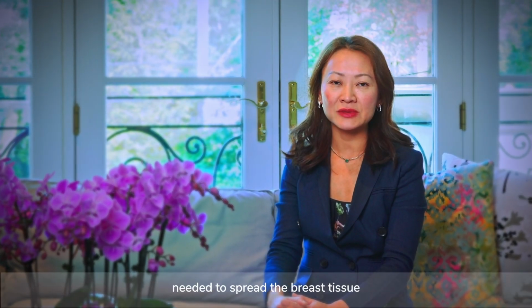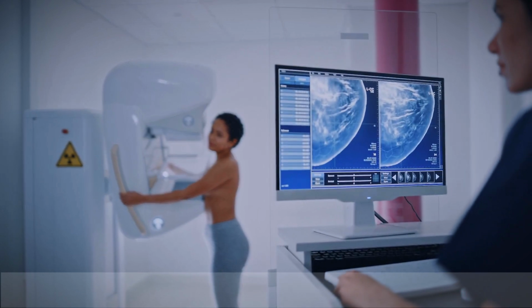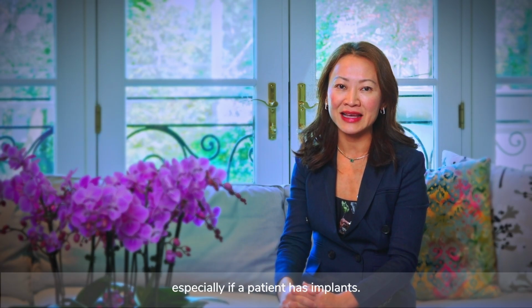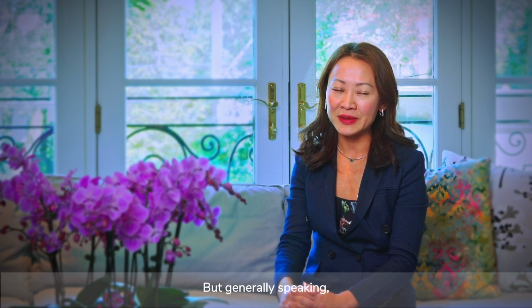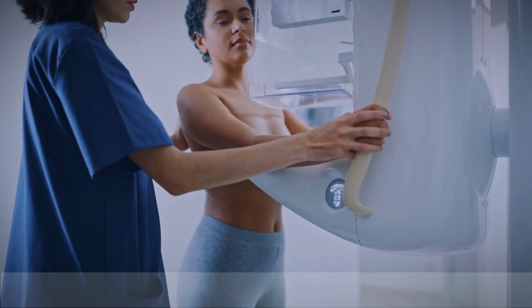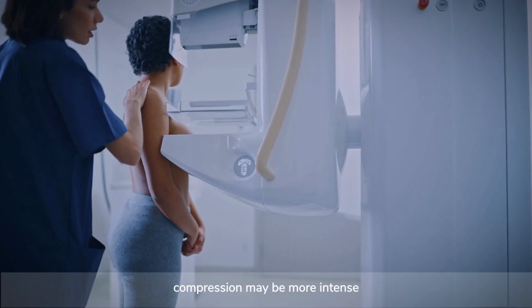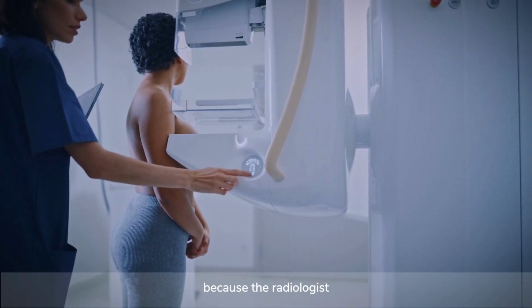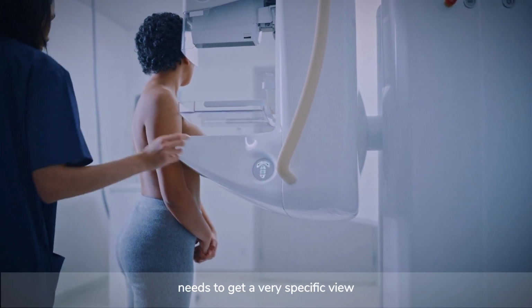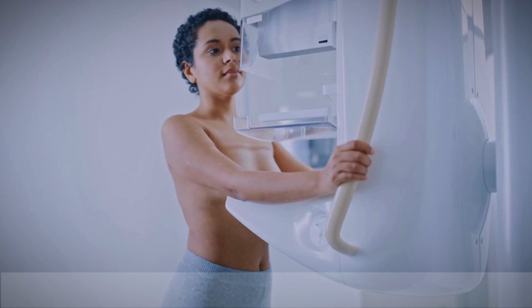Compression is sometimes needed to spread the breast tissue to get a better image, especially if a patient has implants. But generally speaking, compression is less intense in a screening mammogram. During a diagnostic mammogram, compression may be more intense because the radiologist needs to get a very specific view of the certain area of concern.